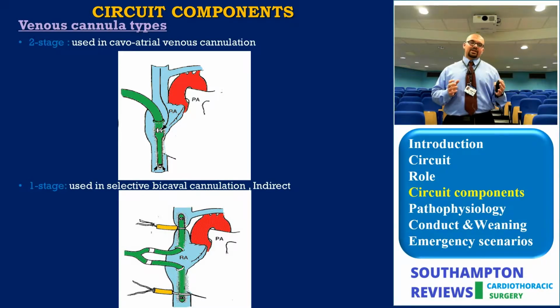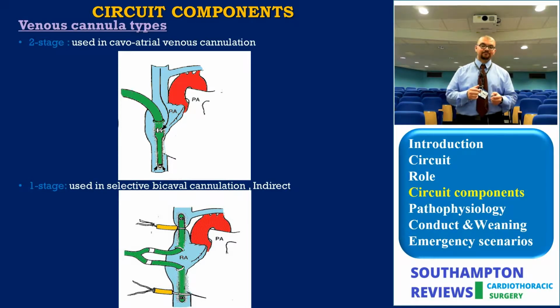On the other hand, in venous cannulation, the venous cannula types are suited for different strategies. These strategies are made for different kinds of surgeries. So you decide which cannula to use depending on what strategy of venous cannulation you will be going ahead with, and this is to suit a certain surgery you're doing. We will explain that more now.